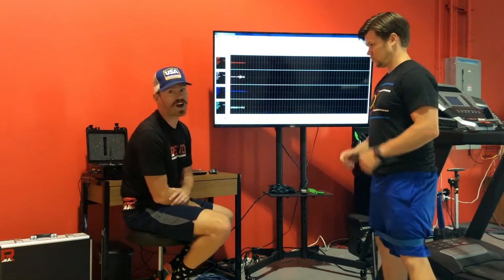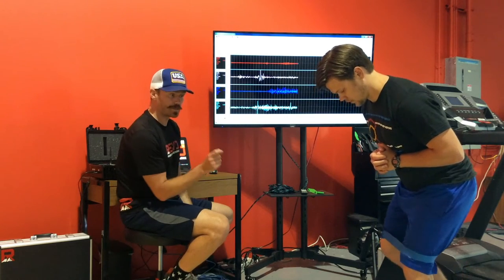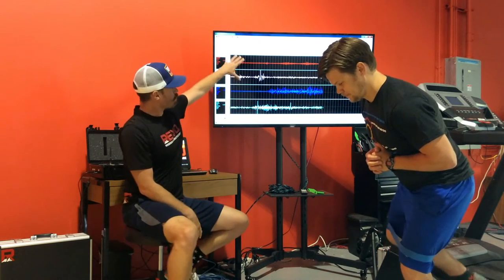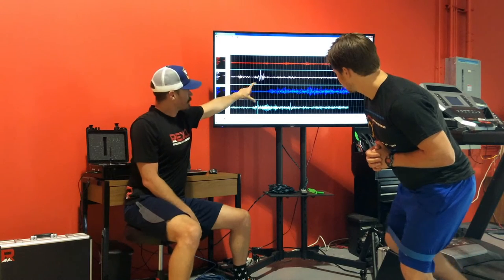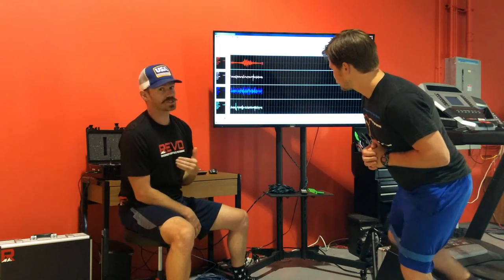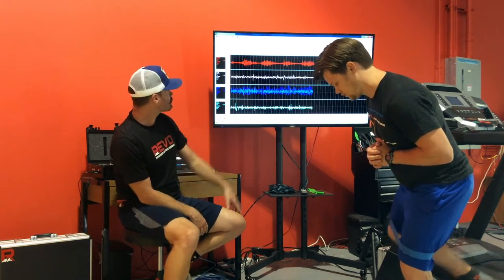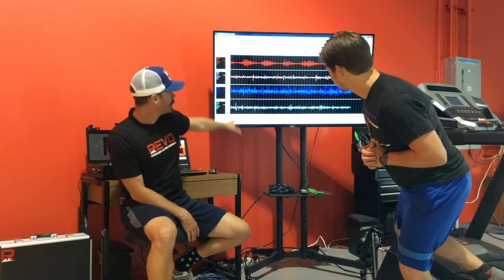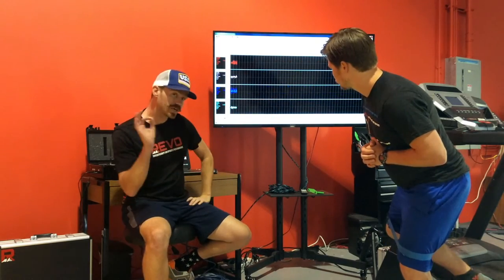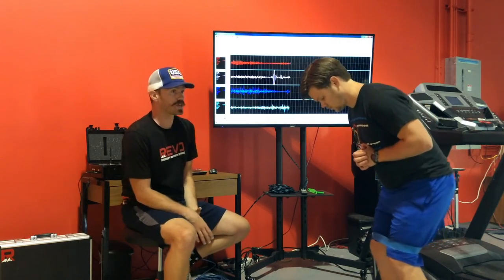Brian's going to do a standing fire hydrant. He's in a little bit of a hip hinge, a little bit of bend at the knee. What we're looking at here — this amplitude is looking at the electrical signal itself. As you can see, when Brian's moving the right femur, he's getting glute max activation — that's the red. Fairly low level hamstring. That's ideal. We want glute max doing a vast majority of the motion at the hip.